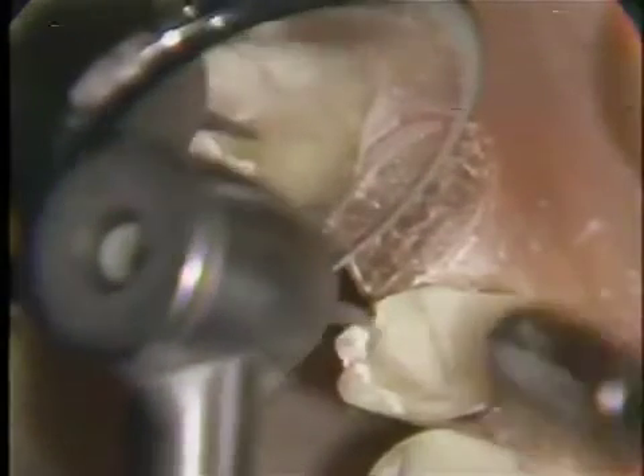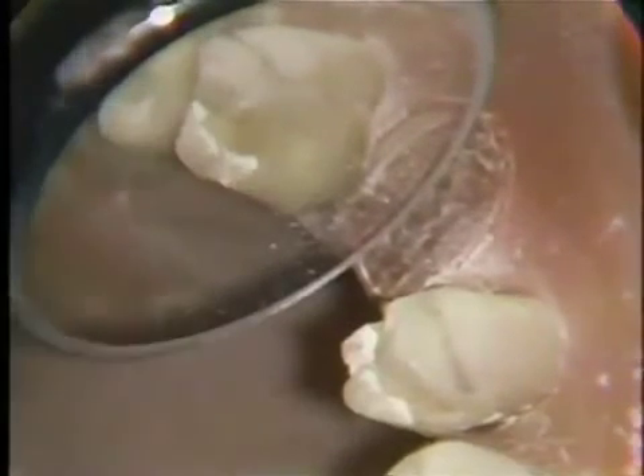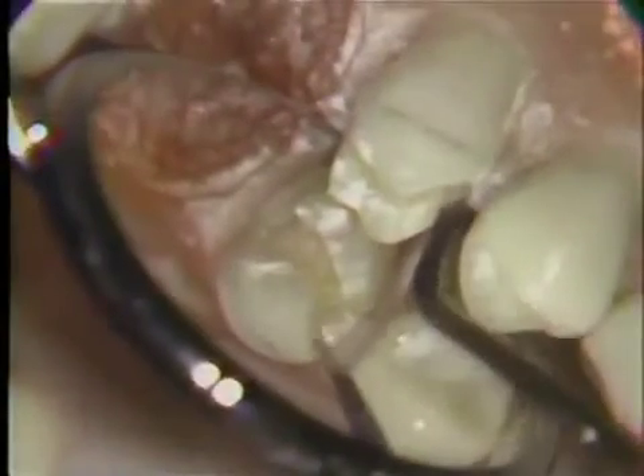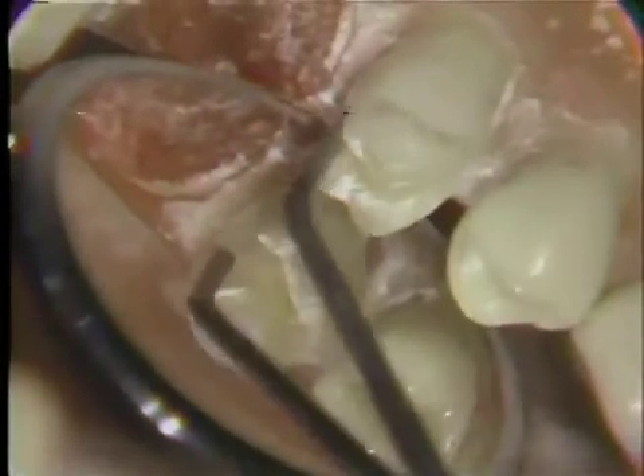When the boxes are completed, the isthmus is prepared. The boxes are further refined using hand instruments to remove any unsupported enamel and to give detail to the mesial and distal boxes.